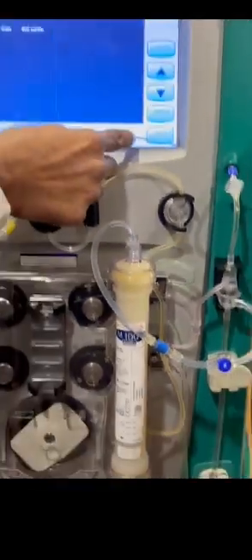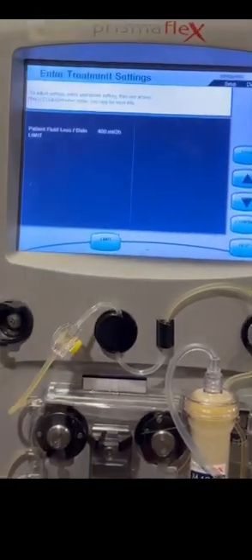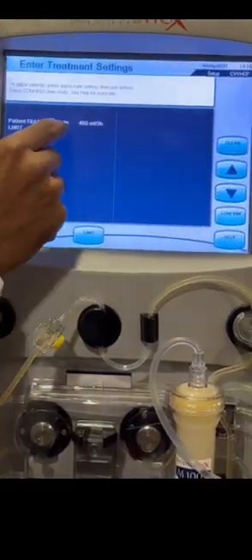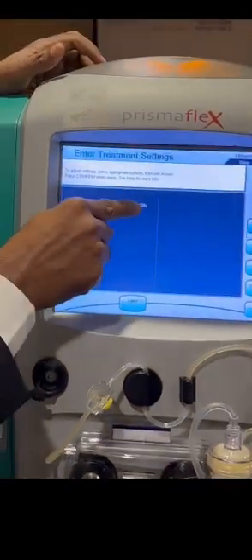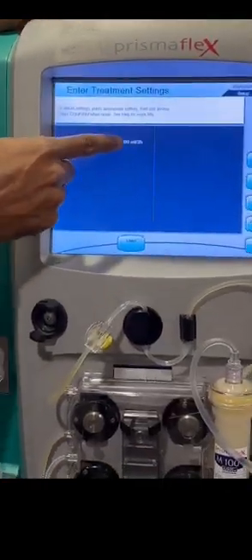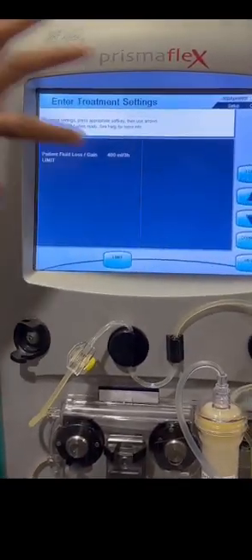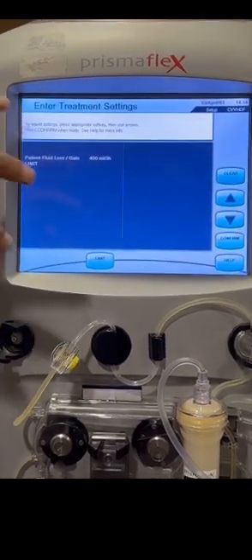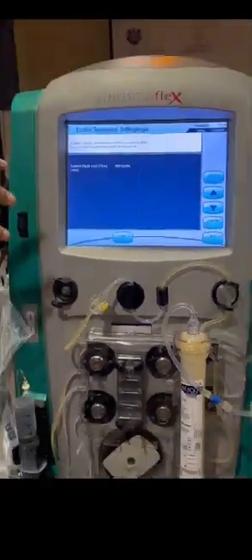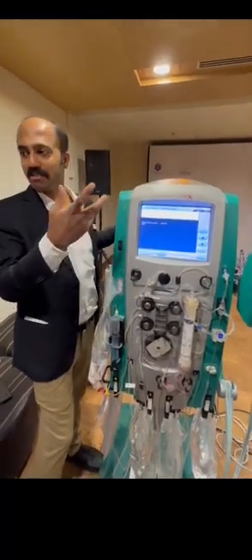So continue. Now we are going to the prescription. Okay, I will tell the prescription separately, but in the machine I will show you. So here we have patient fluid loss and gain. Okay, patient fluid loss and gain 400 ml per 3 hours means in this machine there are multiple checks, because we are giving replacement into the patient body. If I am giving 1000 ml of replacement in an hour, how many liter of solution am I infusing into the patient? Around 24 liter per day.